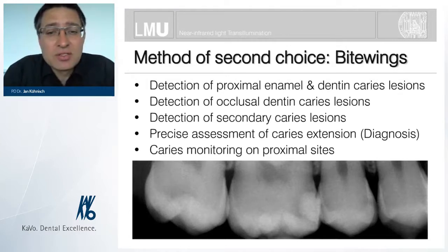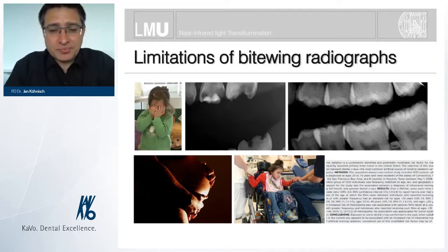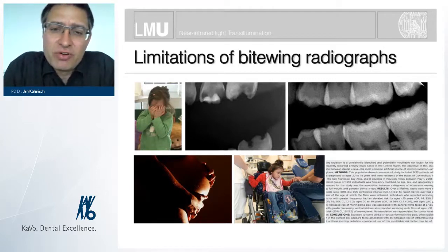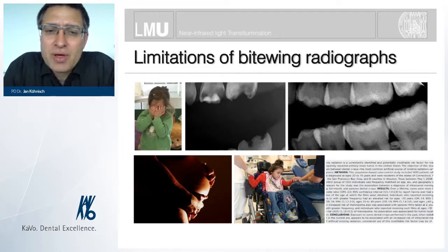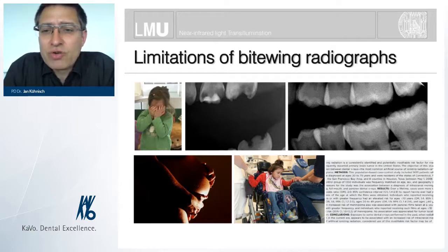And in my eyes, it is an important tool to monitor proximal sites, but there's a small disadvantage that we are using X-rays, which is in some cases not really favorable for the patients. Nevertheless, there are some more limitations, especially think of my daily work, that I have to work with a lot of children, and these children are in several cases uncooperative and do not cooperate in having a good bite wing radiograph.